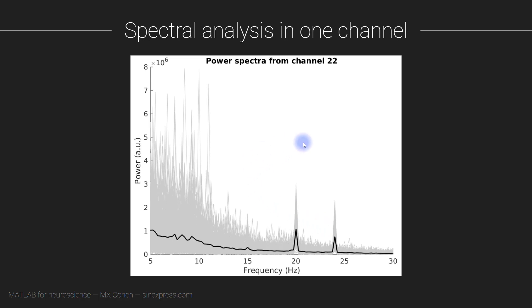Now in this experiment, the same stimulus was repeated many times, as I mentioned in the previous video when we looked at the EEG data structure. There were around 350 trials. All these gray lines here show the power spectra from each of those individual trials, and then the black line is the average over all the trials.